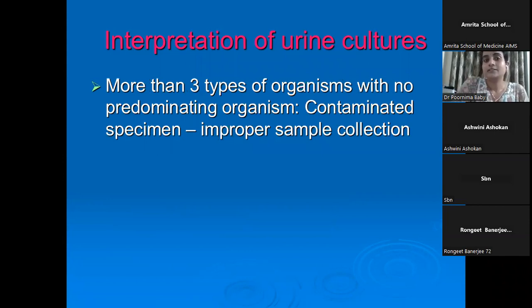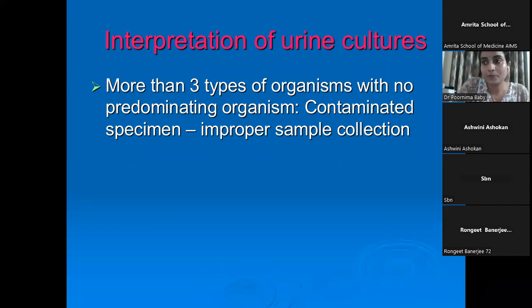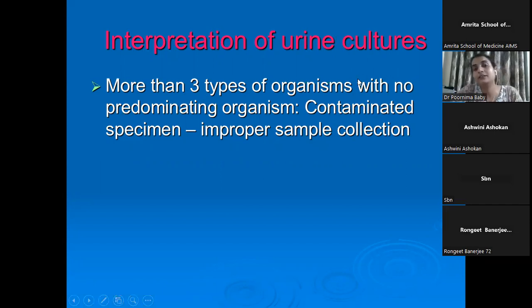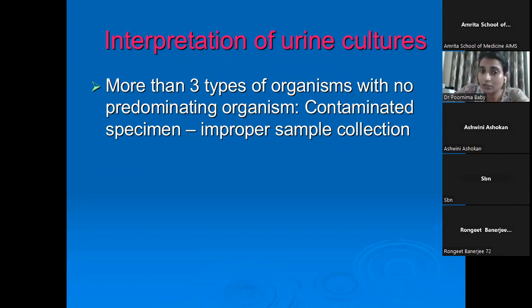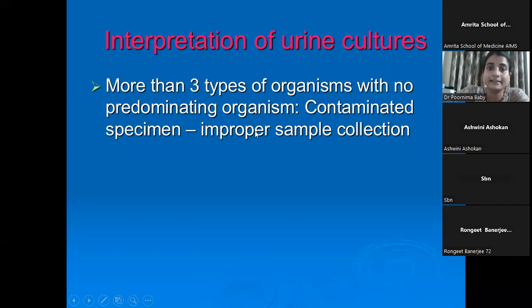Another thing commonly seen is growth of more than three organisms. If it is E. coli alone or E. coli and Klebsiella — two organisms — we do report it. But if there are more than three organisms, it will be difficult to isolate them, and we will not proceed further. We will give the comment that it is a contaminated specimen, which has happened because of improper sample collection. In that case, please instruct the patient to collect the midstream urine sample properly and resend the sample.